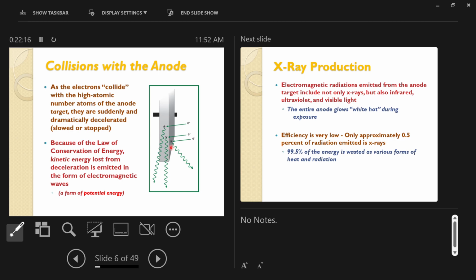What's an example of electromagnetic energy? X-rays? Ultraviolet. What's another good example? Good, okay. Anything else? So we have X-rays, ultraviolet. Lewis told us X-rays and ultraviolet. Anything else coming out of the X-ray tube that's electromagnetic energy? Infrared, visible light. All of those types of light waves are created when the electrons hit the anode disk, okay?